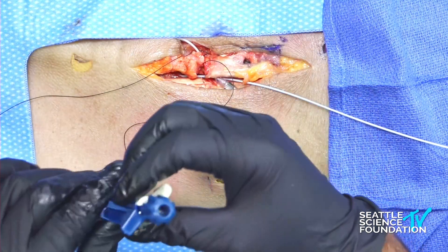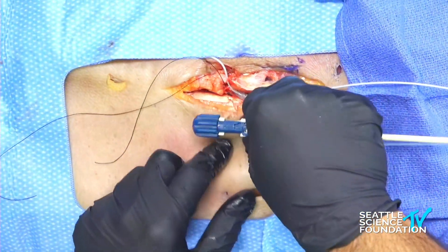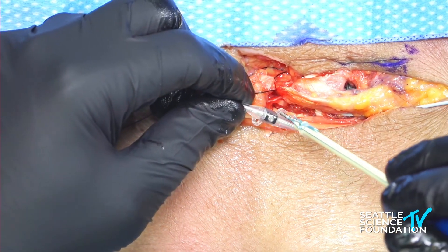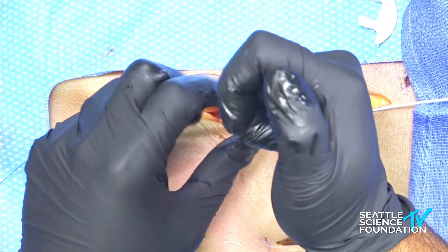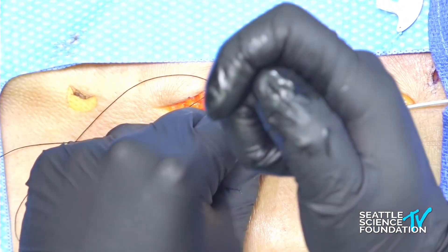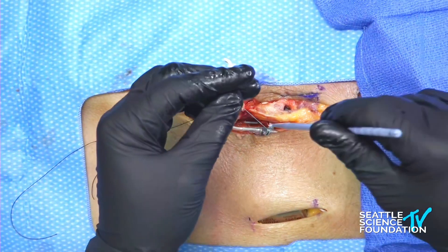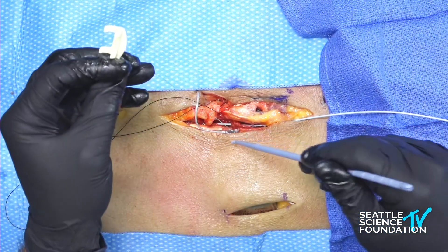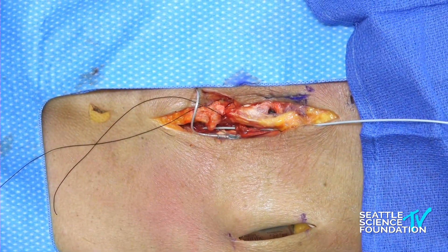This is the Fixate device — an easier way to anchor without having to suture. Those two little holes that I showed you are right in there. This device goes in here and comes around this way. You go into the hole, press down, come back up, turn it, then press going into the second hole. Push down and release — that essentially sutures it down. You use the notch to get the wire and bring the loop all the way down. Then use the other end as a cutter to cut the wire. That completes the anchoring.